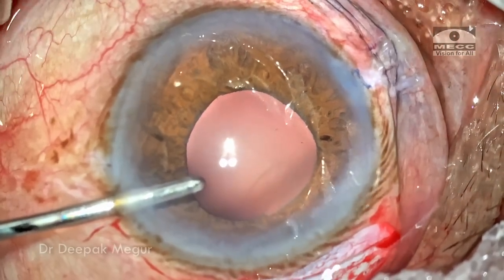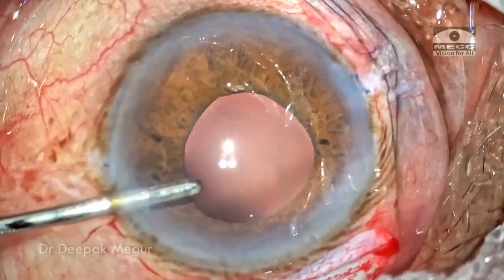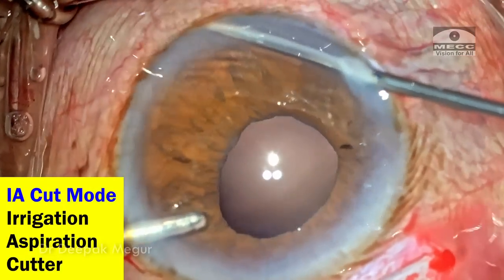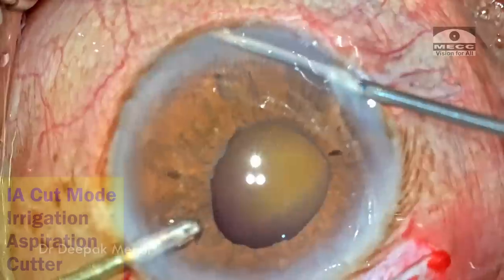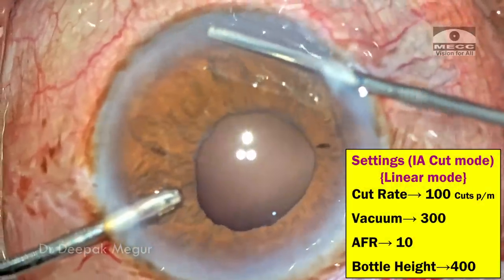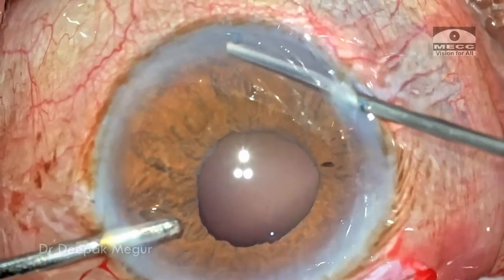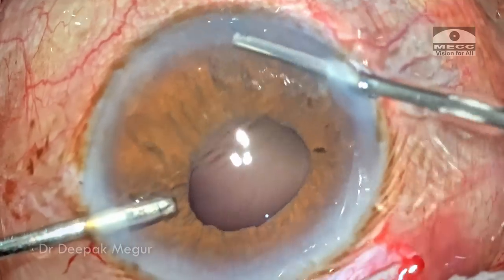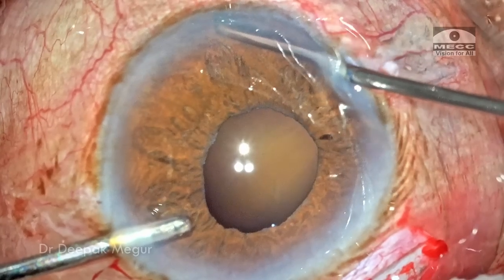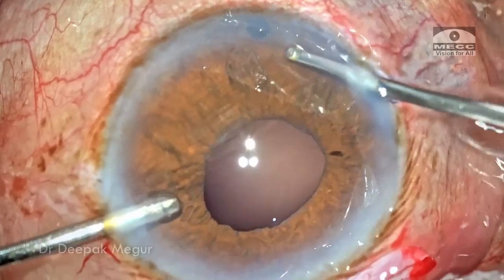Time to perform a peripheral iridectomy. The superior area visibility is not so great because of a thick arcus, so I'm going to do an iridectomy at the 6 o'clock position. The typical settings are irrigation-aspiration-cut mode with cutting kept in a linear mode, set at a maximum of 100 cuts per minute — this is a very controlled way of performing an iridectomy. Going to foot pedal position 2 engages aspiration which grasps the iris, and pressing to position 3 induces the cut. Using just a couple of cuts gives us a nice little hole in the iris.